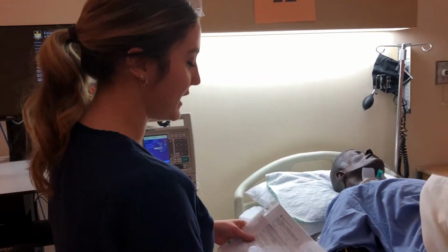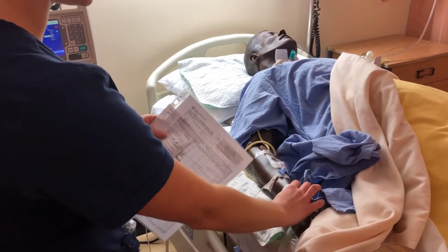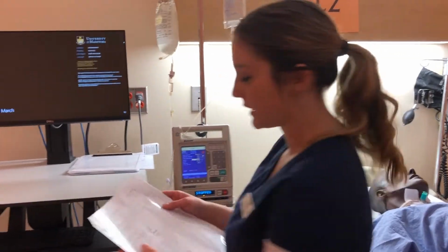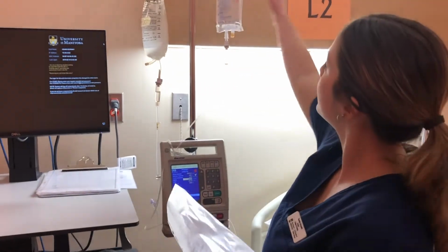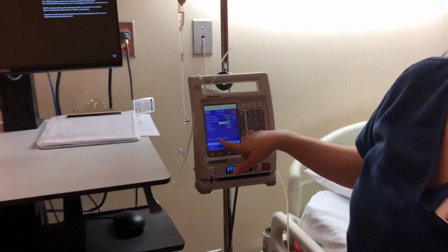So I'm comparing my patient again, Wendy Holmes, her FIN, her birth date, and all matches, and she's going to tell me again just to be safe. My medication is heparin is what I have, and it's for VTE, and that's what I programmed into the pump as well.